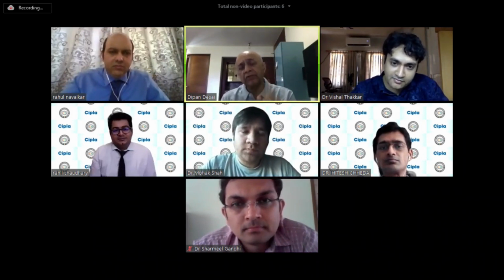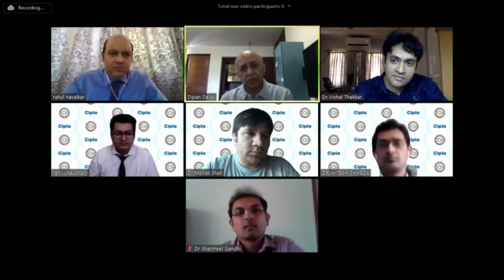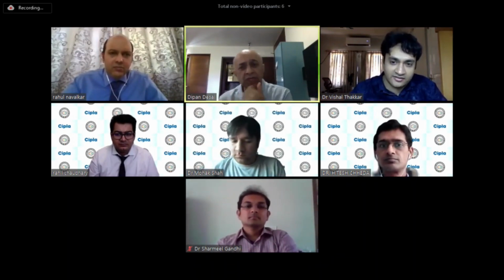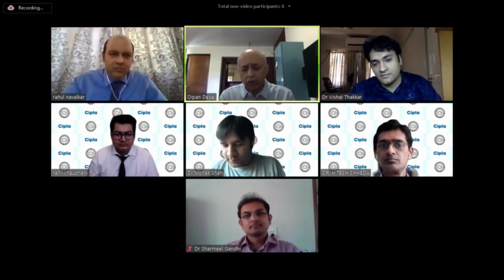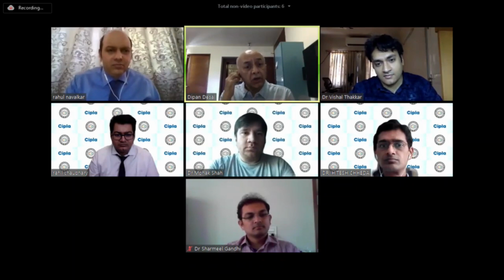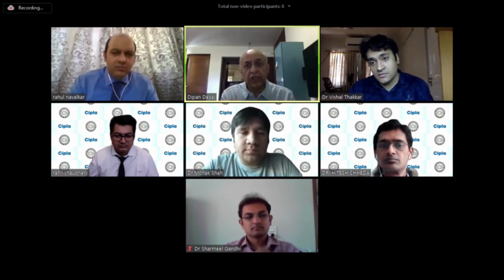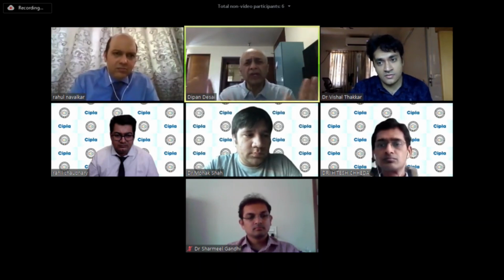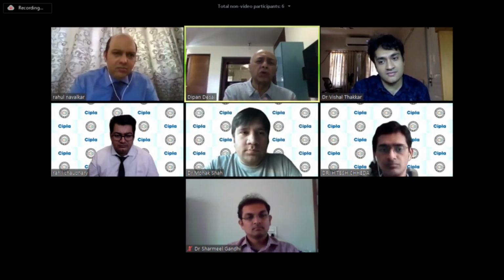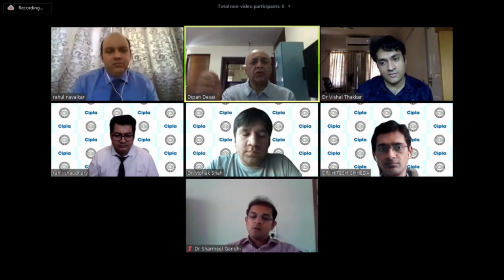You got a very important point, Vishal, of ray tracing. Today, the newer IOL formulas, as mentioned, Barrett, and another formula, which I forget the name, mentioned by Dr. Sonu, are going to use ray tracing technology. And ray tracing technology, if you see, he does so much refractive surgery, is going to play an immense role in the future. Let's talk about the newer intraocular lenses beyond a monofocal lens. You are going to get refractive surprises, whatever you do, whether it is monofocal, toric, multifocal. With all the latest formulas, 90% are within plus or minus half. You have another 10% to deal with.